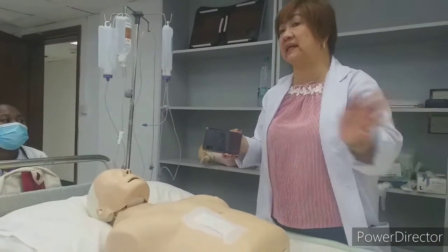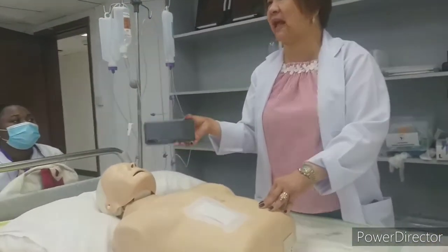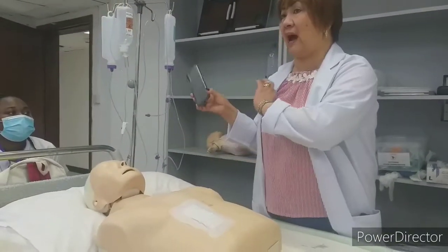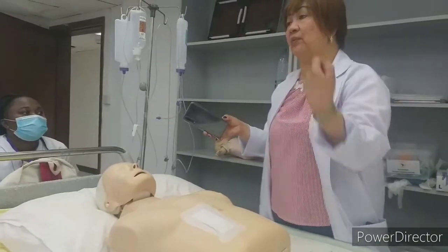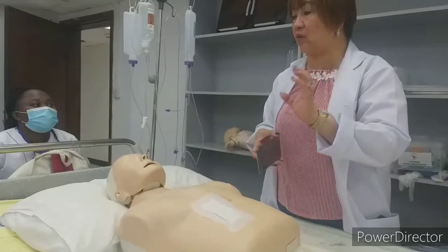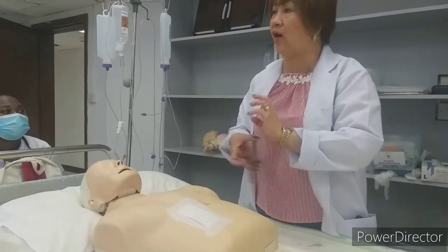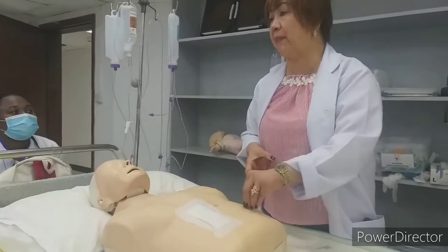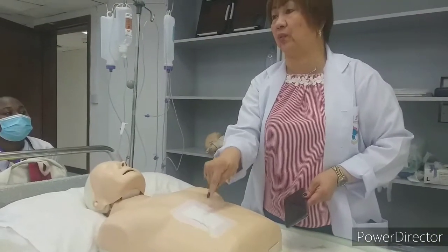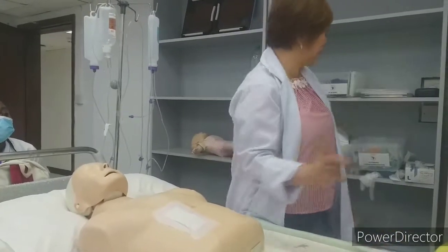Peg tube is already something like permanent or longer. NGT is sometimes temporary only. Once the patient is about to eat, that NGT will be out. But those patients, elderly ones, comatose, or needing longer rehabilitation, go with the peg. So for the peg tube, we need to care like the way we do with the dressing. So peg care, there must be like a tube.